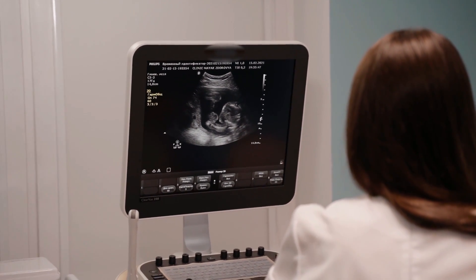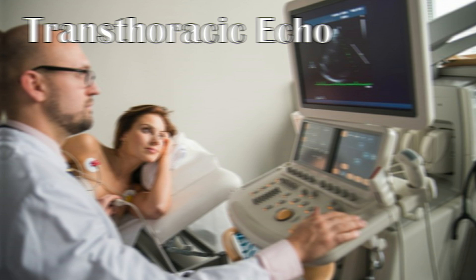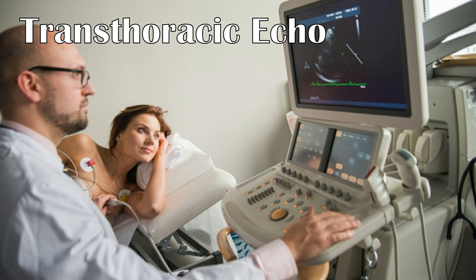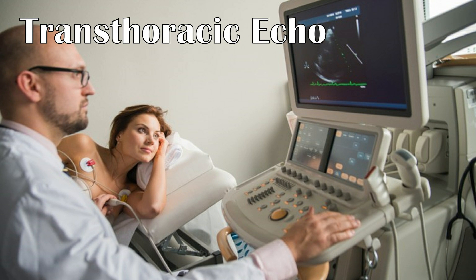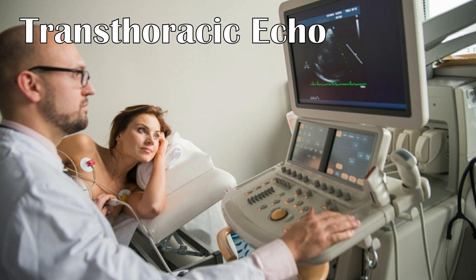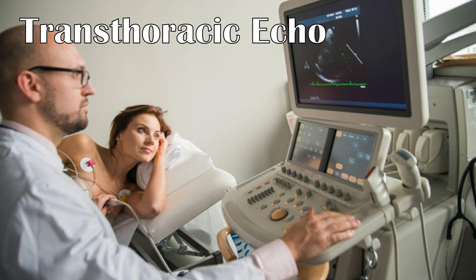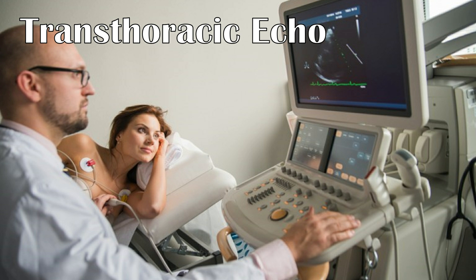There are several different types of echocardiograms. Transthoracic echocardiogram is the most frequently performed type. Early patient preparation is not required for a transthoracic echo. Patients are asked to remove the clothing covering the upper part of the body and lie down on a bed.